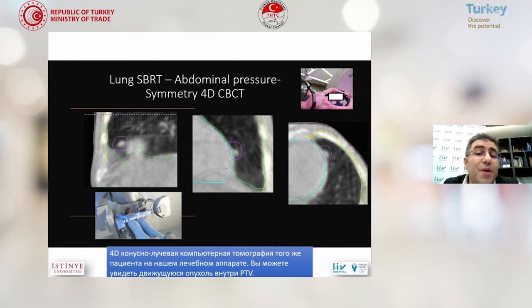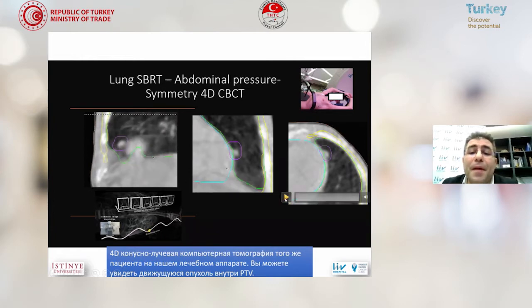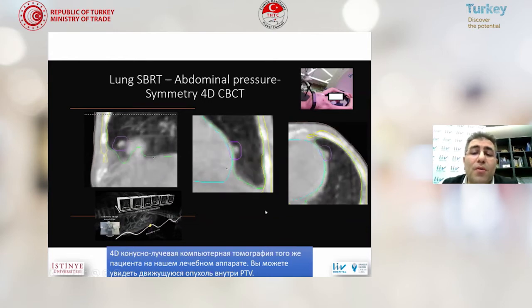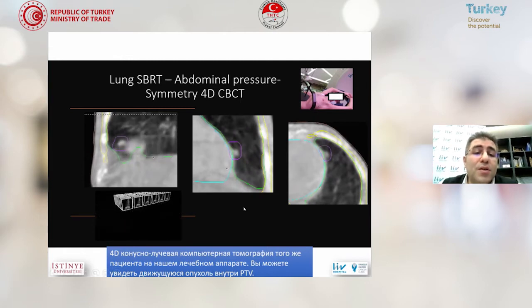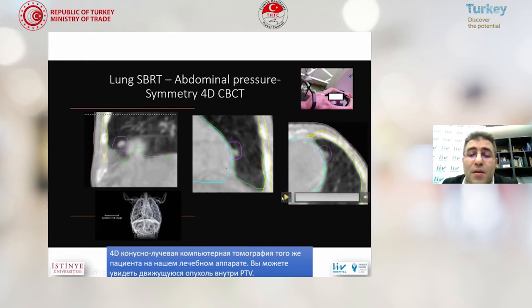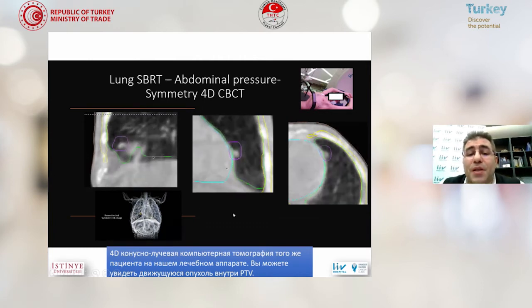So, of course, whatever you plan, we don't know if you can give this radiation correctly in the treatment machine. So again, in the treatment machine we have 4D cone beam CT in our system called Symmetry, which is a very slow computed tomography of the lung. As you see, the tumor is still inside of our treatment volume. It is good to see because this is a heart area to treat, with some risks, so you don't want to irradiate the wrong places. Seeing this 4D cone beam CT is very helpful for us to be sure the radiation is correct. After seeing that, we give our radiation.